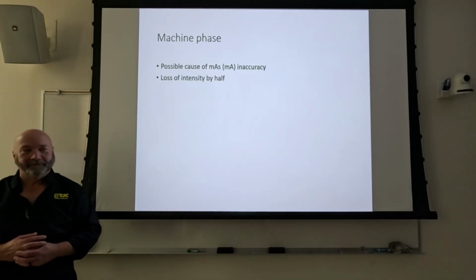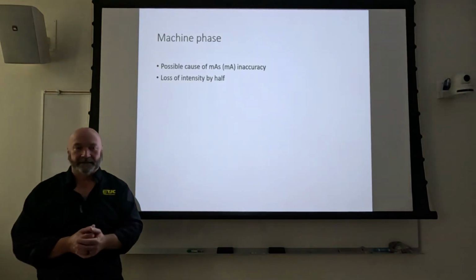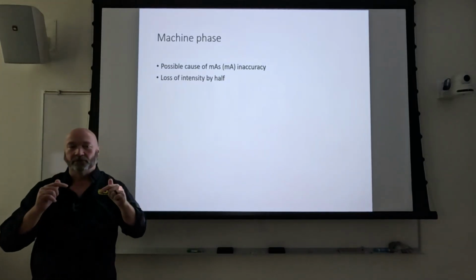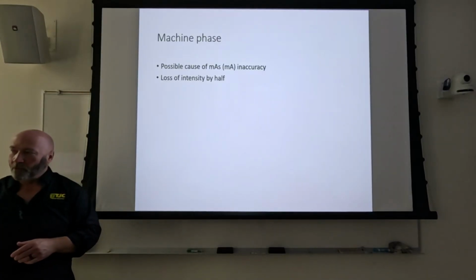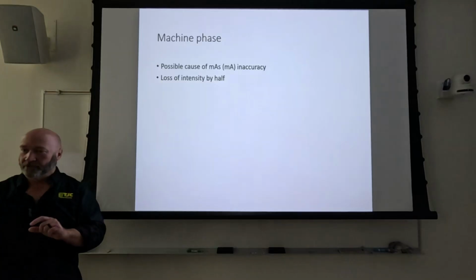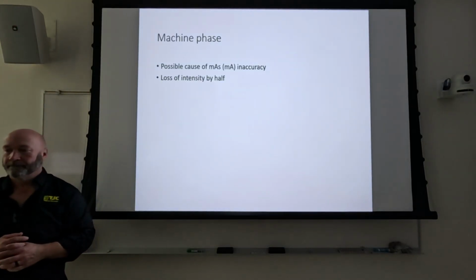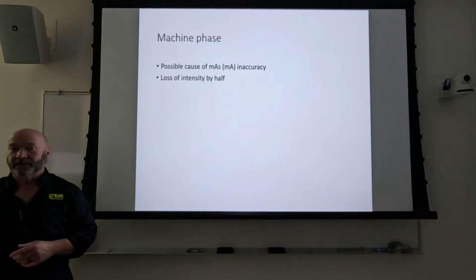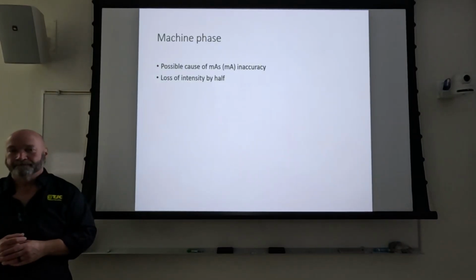This is digging deep. Distance? Like distance? Distance, let's say you use the same distance. So everything you did was exactly like you did it the day before. Okay, so think hard. What things exactly double or half your, let's say double your tube output? It's the same phase of machine, so you're using the same room, so it's not single phase versus three phase, but it's along those same lines.